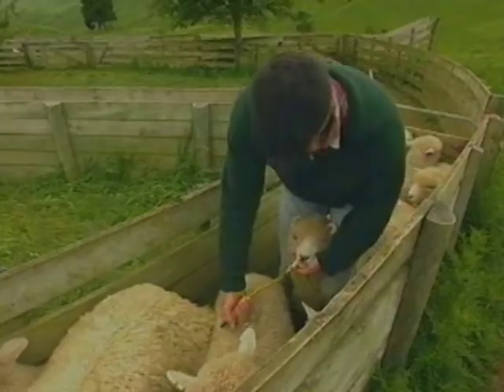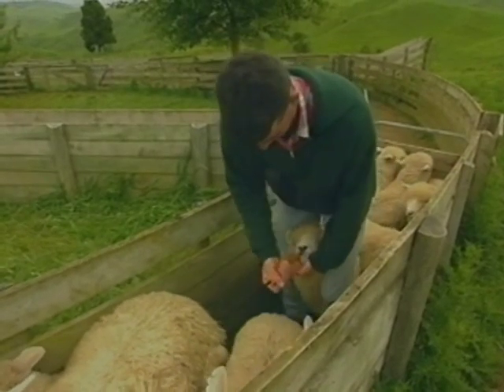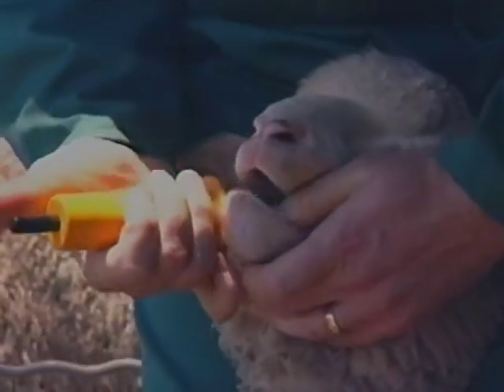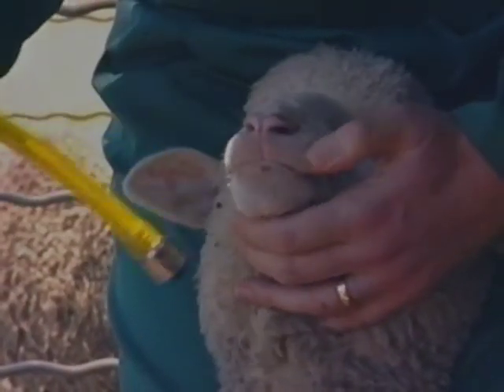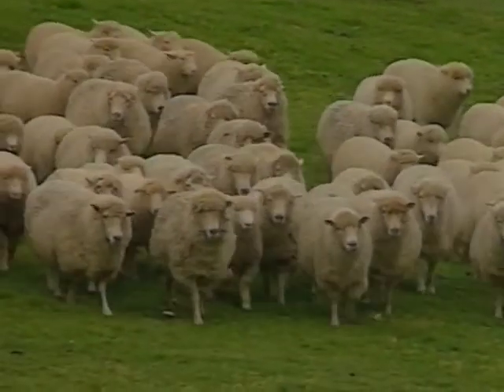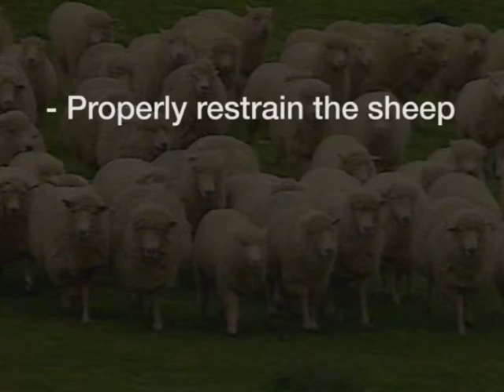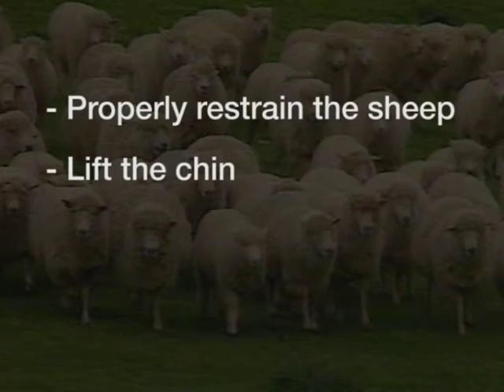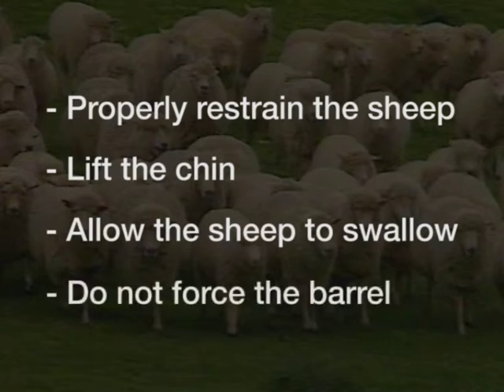The procedure is exactly the same for lambs. Again, straddle the lamb's neck, keeping its head and ears against your thighs. Lift the chin to straighten the angle between the head and neck. Use the swallowing reflex to guide you — never force it. Whether you're dosing ewes, hoggets or lambs, the administration technique remains the same. The key points are: properly restrain the sheep — straddling the neck is best; lift the chin to straighten the angle between the head and neck; allow the sheep to swallow throughout dosing; and most importantly, do not force the barrel down the throat.